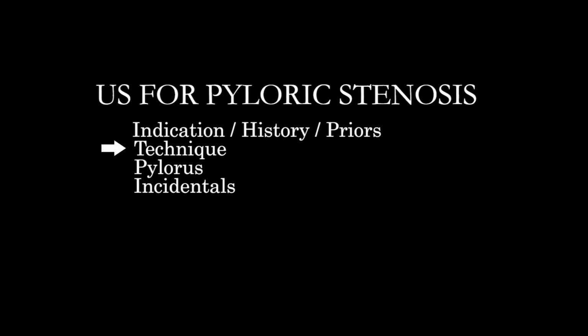As with all ultrasound studies, if you need to scan real time, that's something you want to do, and then once you are in the room and obtaining diagnostic images, we'll evaluate the pylorus and then go through the various diagnostic criteria for pyloric stenosis. And if there are any potential alternative explanations, we'll take a look at those as if they're incidentally imaged in the adjacent anatomy.